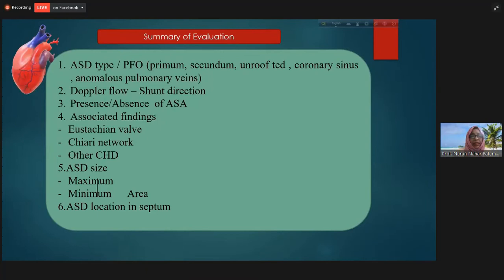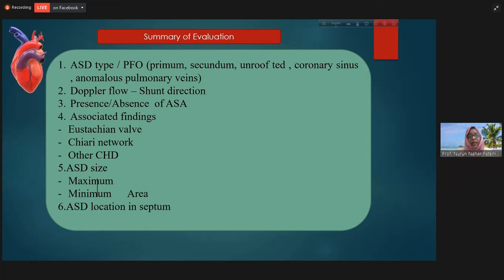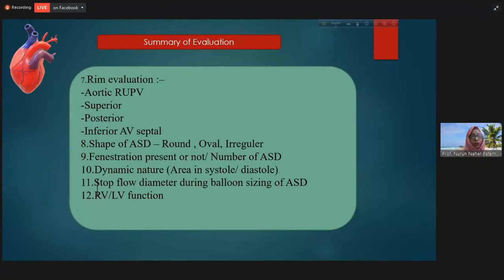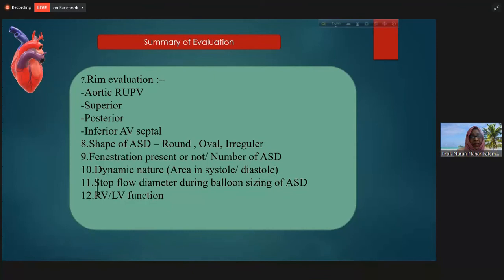In summary, we can evaluate the ASD type, presence or absence of patent foramen ovale, Doppler flow and direction of the shunt, and chamber dimensions. We can also see if there is a Eustachian valve or Chiari network, measure the circularity index — whether the ASD is circular, oval, or elliptical — do rim evaluation, and assess the dynamic nature of the ASD: whether there is a large difference in ASD dimension between systole and diastole, which requires selecting a slightly larger device.